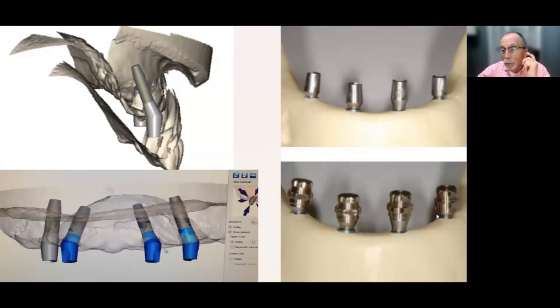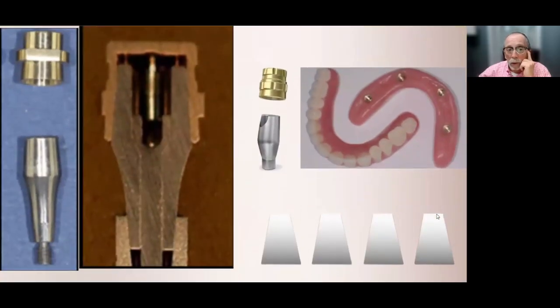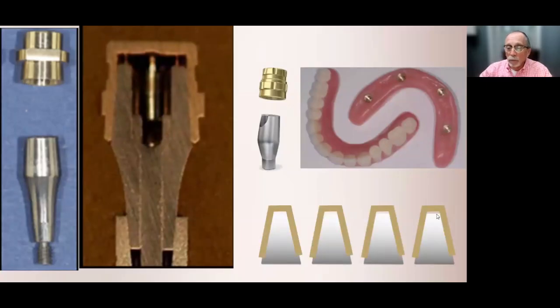And they're very retentive, obviously, to the acrylic. You see all the knurling, and the retention is off the charts, right? This really requires education and delivery with the patient of practice getting it in and out because the retention is pretty good. And as I said earlier, with age, right? Because you've got four of these things, and my analogy is you've got four beer glasses that are linked together, and if you've got moisture between them, how hard are they to pull apart? And they're very hard to pull apart.